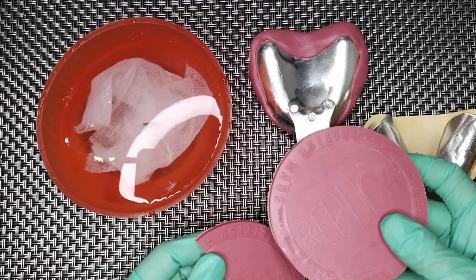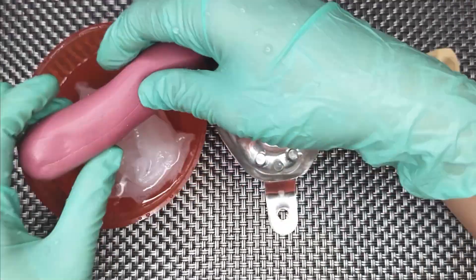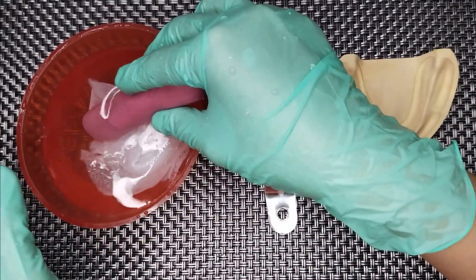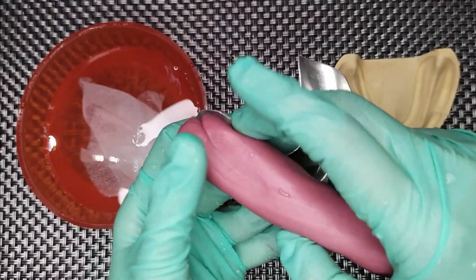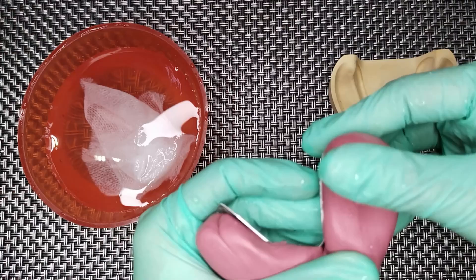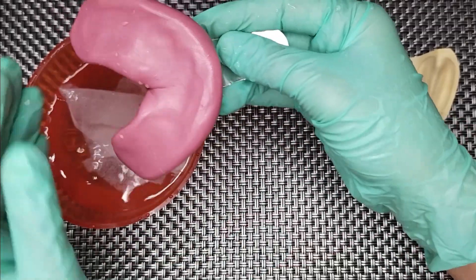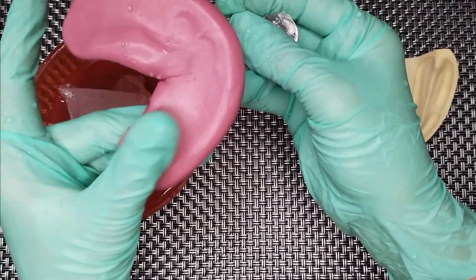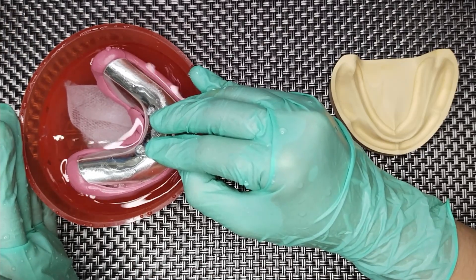Follow the same procedure for your mandibular impression. For the mandibular, form it into a log and then load it to your tray from one end to the other. Make indentations on the impression material for the arch of the mandibular. Then, heat it again before making the impression.